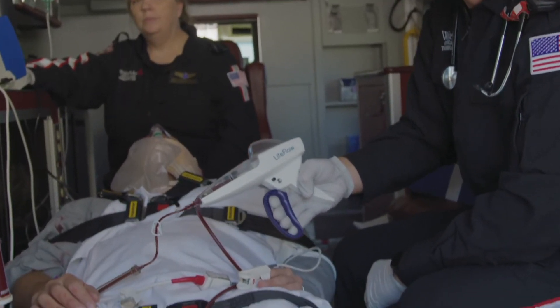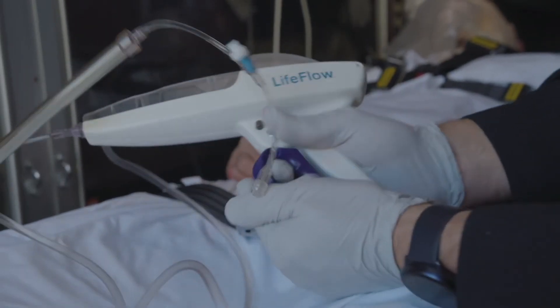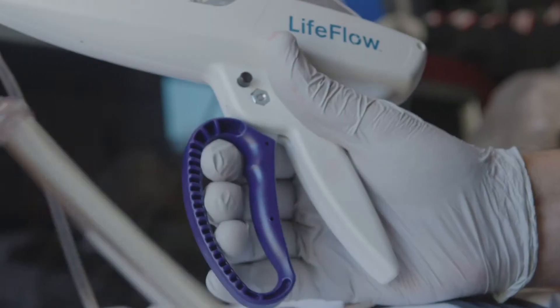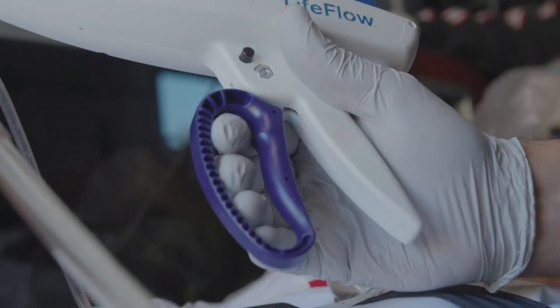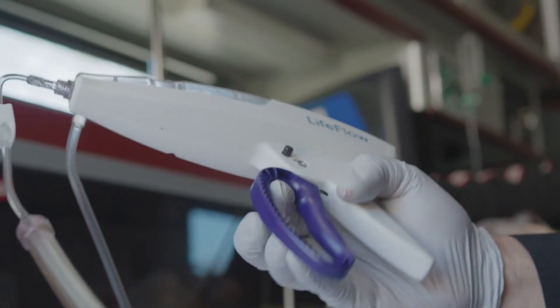The trigger loop provides a tactile feel and is designed to break away if excessive force is applied. This is a safety feature. If the trigger loop stops moving, do not force it opened or closed. Stop infusing and begin troubleshooting at the top and move down.